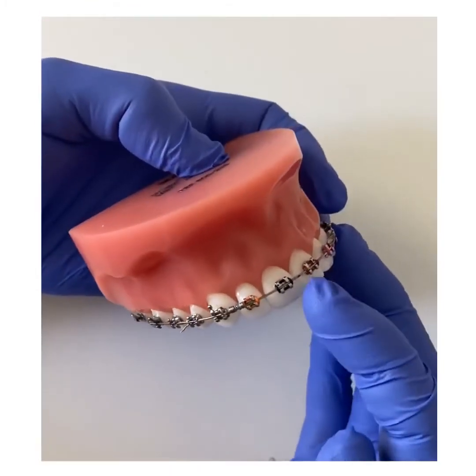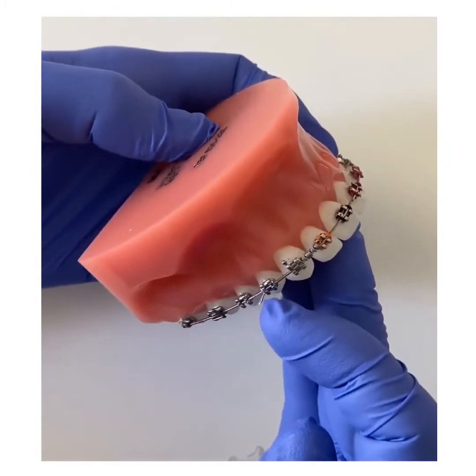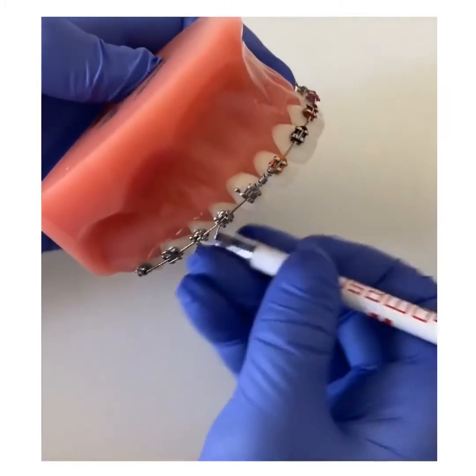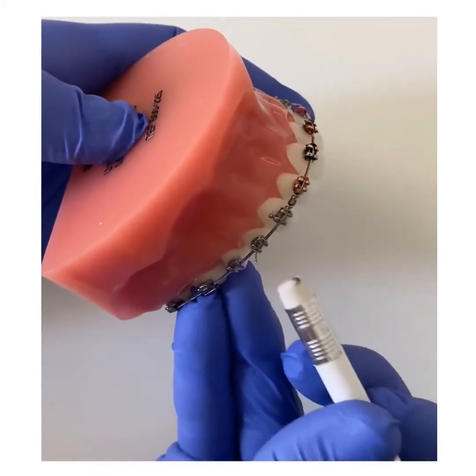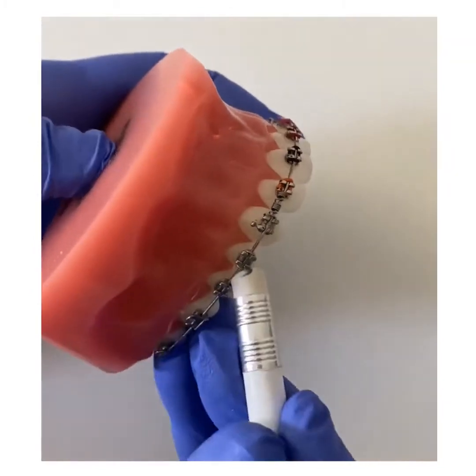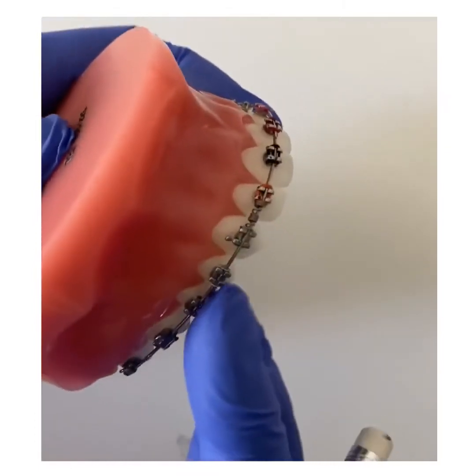Along your braces, you may either have an elastic tie or a metal tie. As you can see, this little piece here is sticking out. To make yourself more comfortable, take a pencil with an eraser end and gently tuck and push this little projection towards the tooth, as best as you can. And that already feels more comfortable.